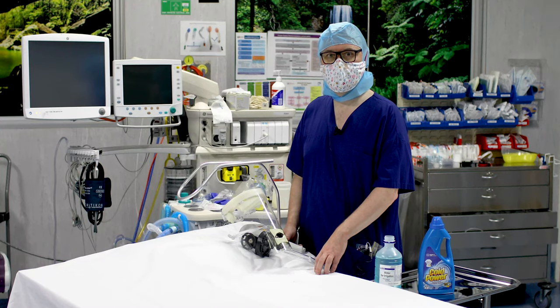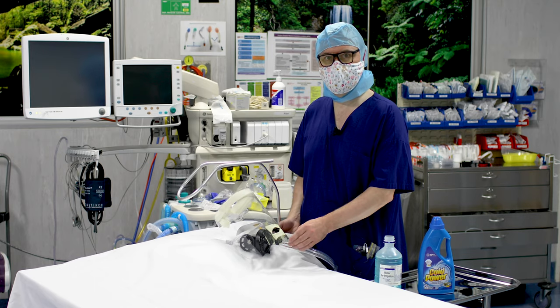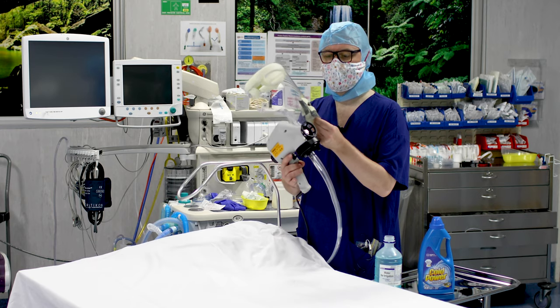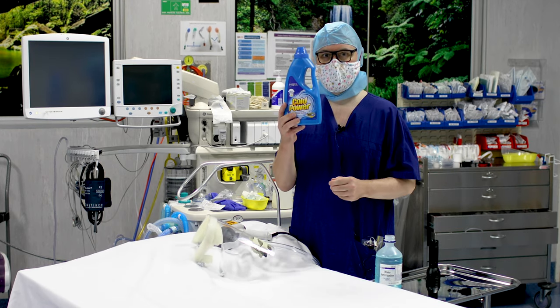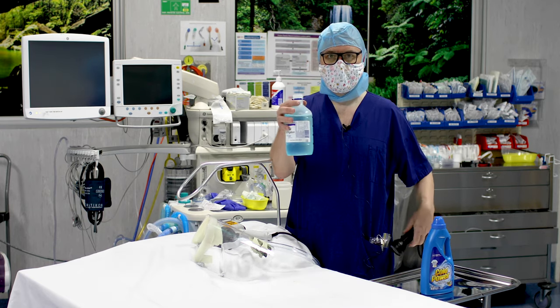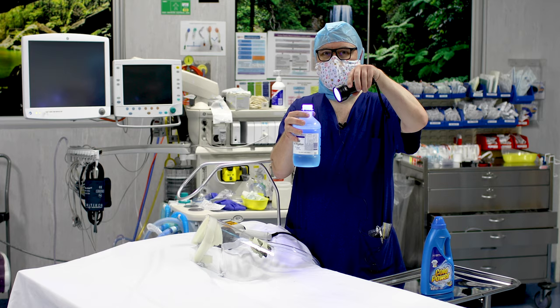In this video, I'm going to test some possible containment measures for aerosols generated during intubation and extubation. To do this, I've made a crude cough simulator with a paint gun and some polycarbonate. I'm going to use this to spray cold power, which is being diluted in water, and I'm using this because it fluoresces with my 365 nanometer UV torch.